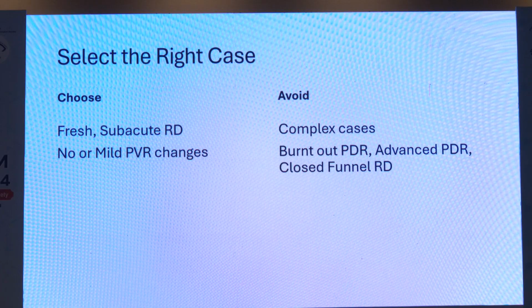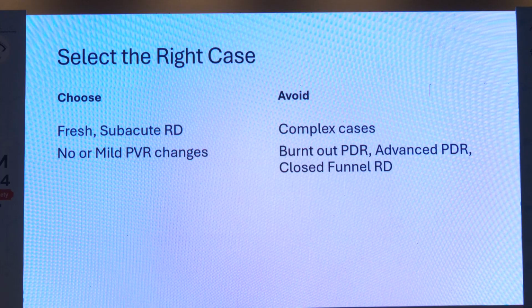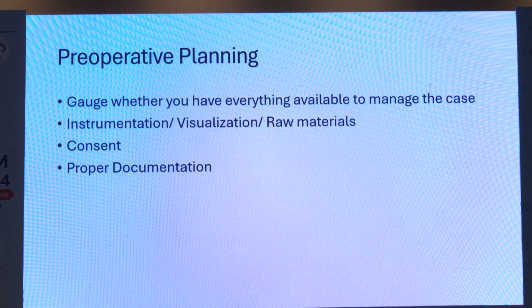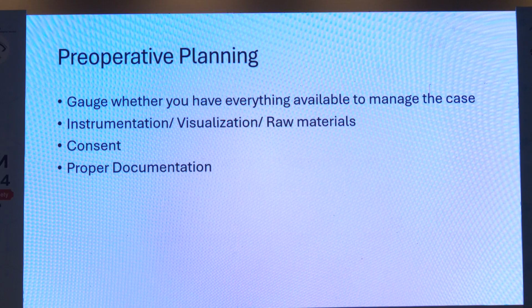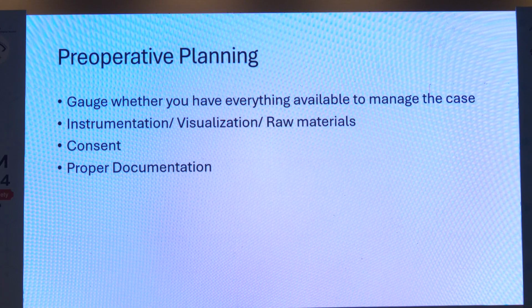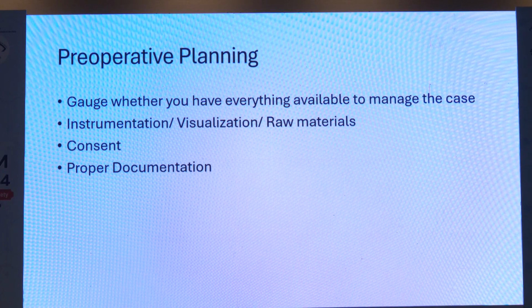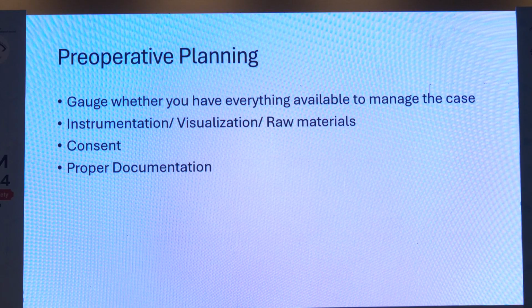So again, select the right case. Simple cases, single break, fresh RD, less PVR changes, select them first. As you move on, you will be able to do the more complex ones. So initially just avoid the advanced PVR ones. Then preoperatively, you have to plan very well. You have to gauge whether you have everything available to manage the case, from instrumentation to visualization, raw materials. Take a proper consent in the language of the patient. Proper documentation is very important from pre-op, intra-op to post-op.